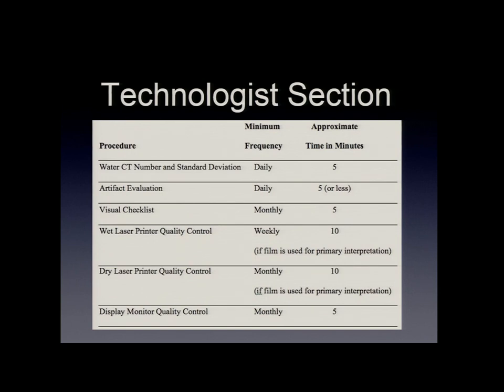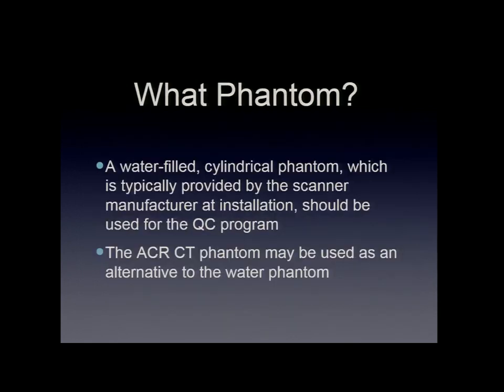And then, of course, the display monitor quality control. That's where the CT tech is sitting, where they're operating, and they see the images that they acquire pop up, and so there is some QC required monthly for that.